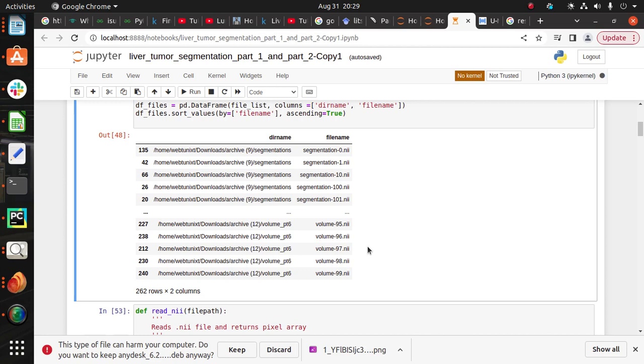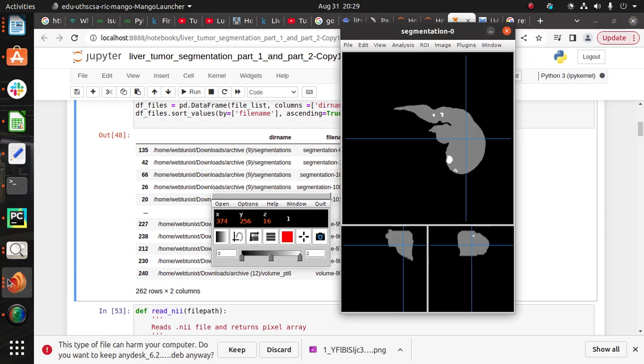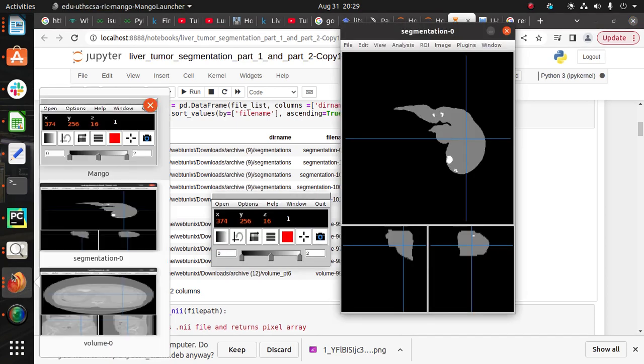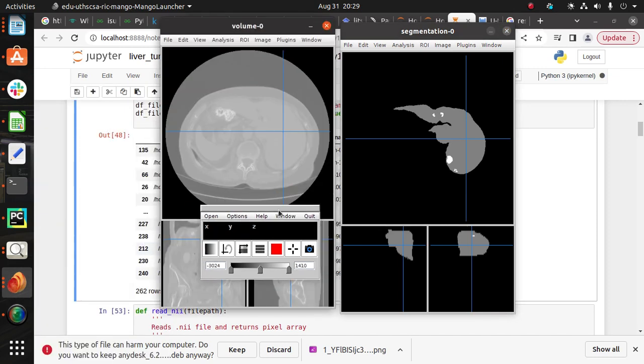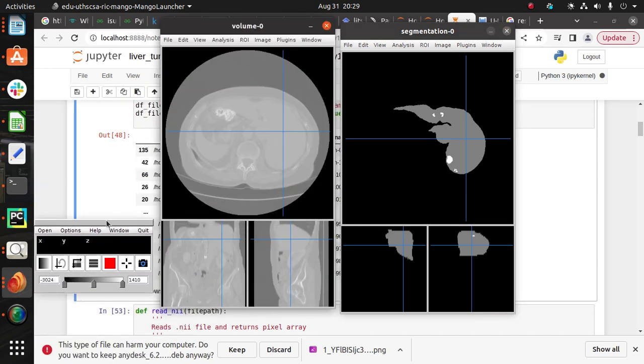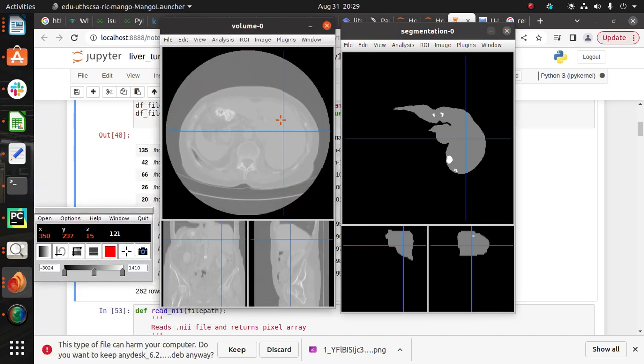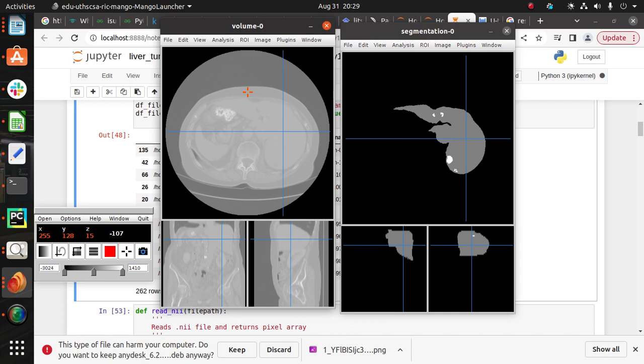So here I can open our volume image and the segmentation image. The volume image is our original image. In the original image you can see it is difficult to see the liver and tumor.